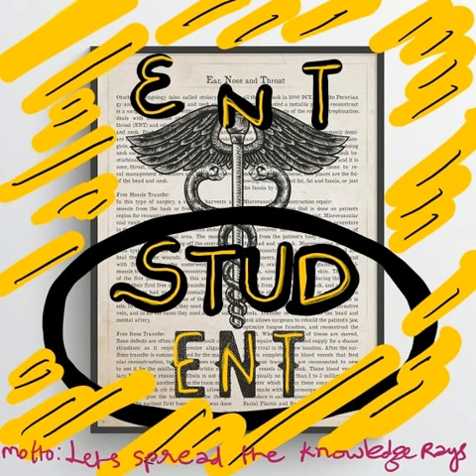First, the important landmarks of the lateral surface of the bone, like the spine of Henle, mastoid tip and linea temporalis, are identified. Spine of Henle is a variable landmark that lies posterior superior to the external auditory meatus. It is better to avoid using it as a sole landmark.